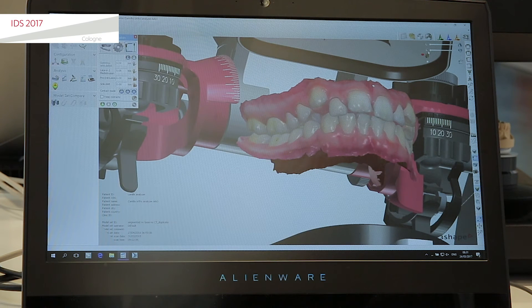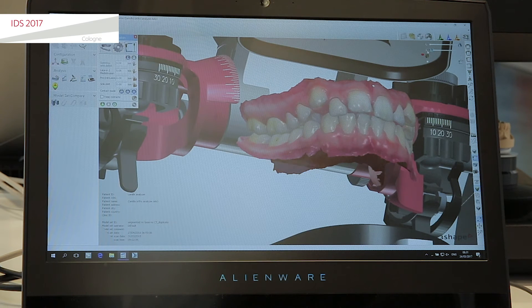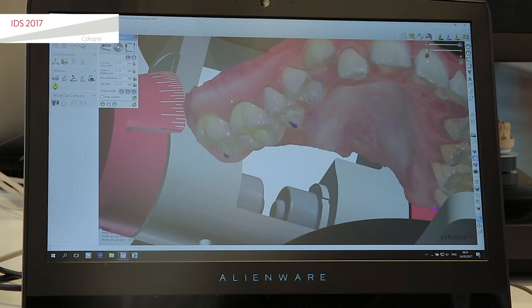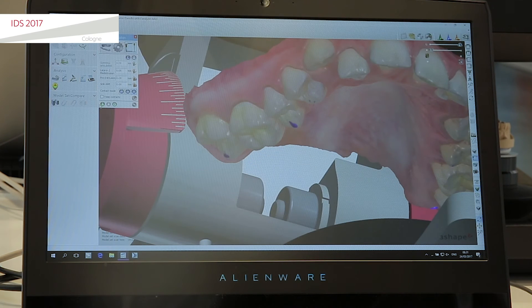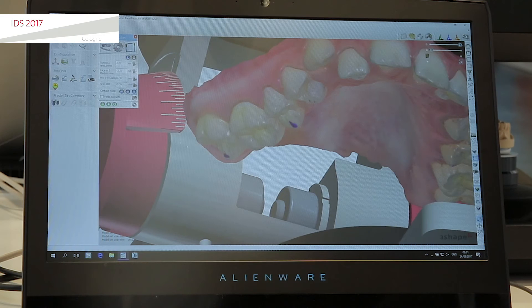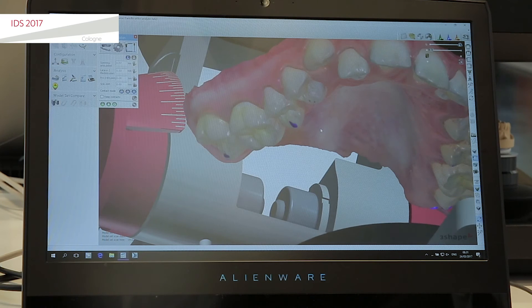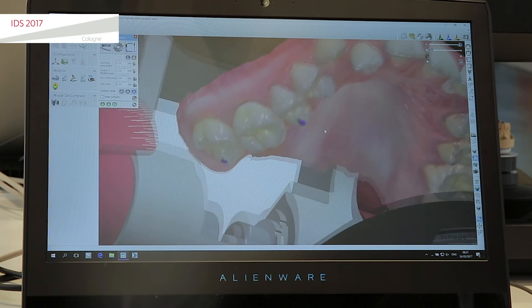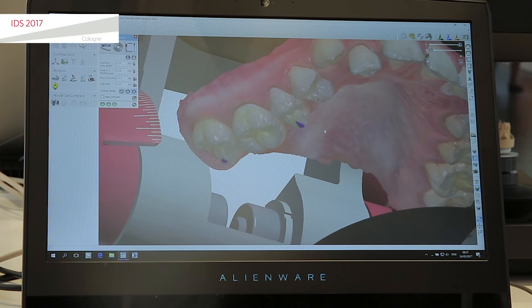Let me remove the mandible really quick here. As I zoom in and do the chewing motions in the articulator, I can see all the contact points here to make sure I have a good and very functional bite.